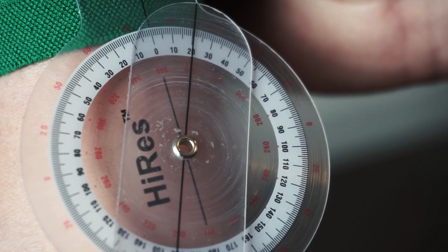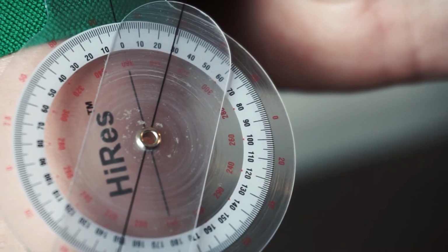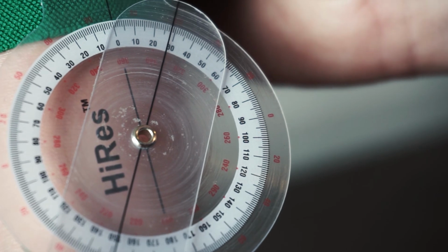I'm going to apply a little bit of force, looking for that firm end-feel. And we get to 28 degrees of passive eversion. That's how you do it.